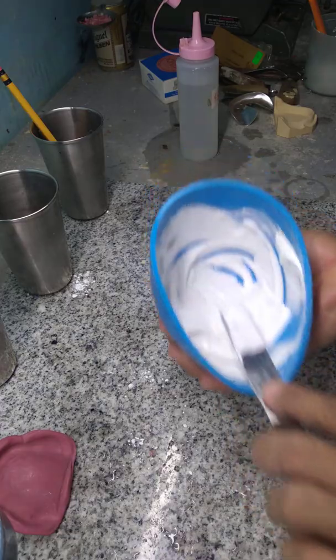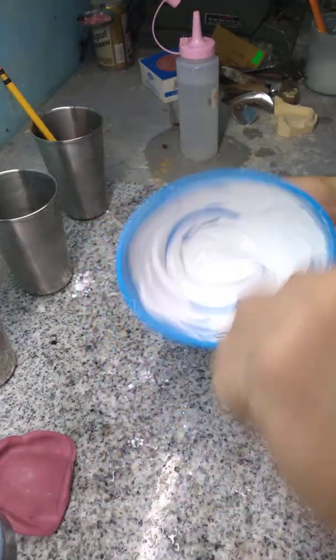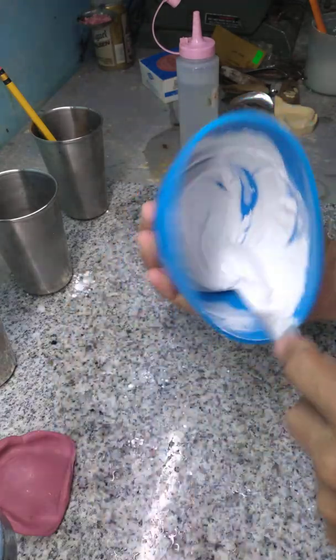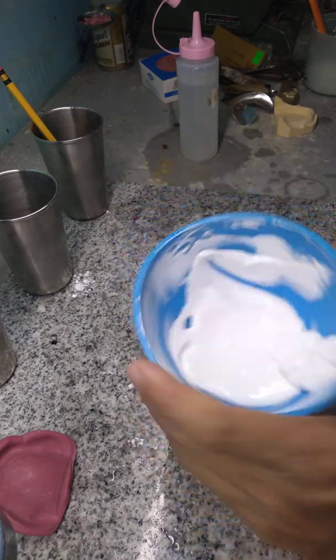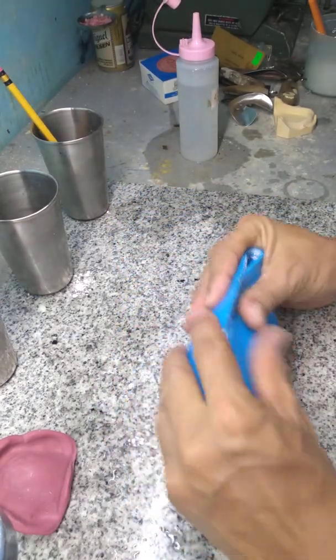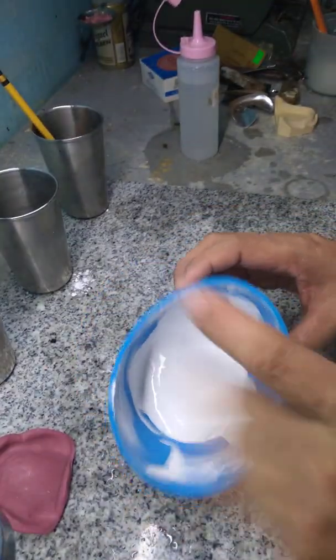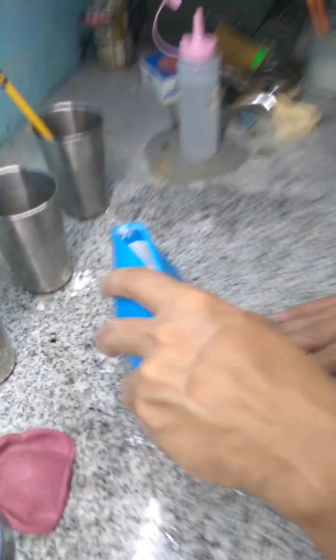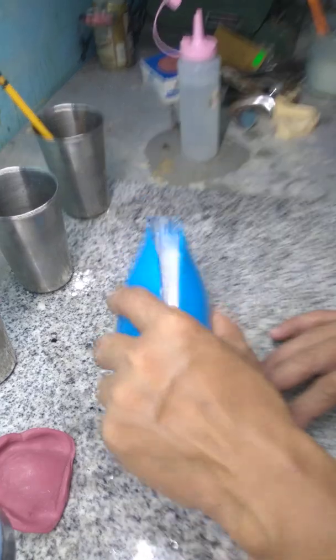You should have this consistency for your plaster mix. Then cover the lid to eliminate bubbles. Of course, if you have a vibrator, that will be helpful.